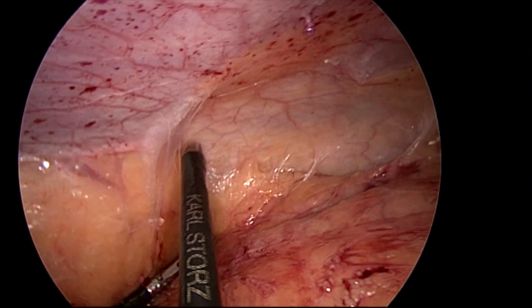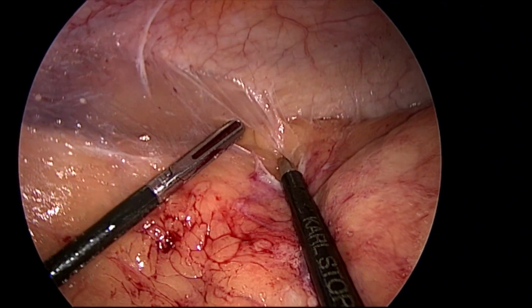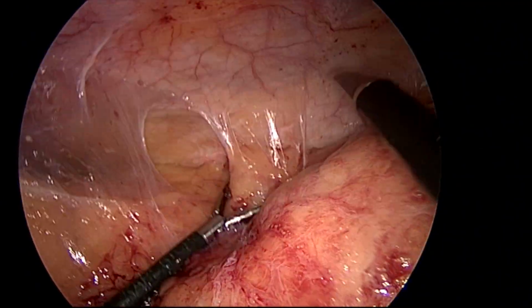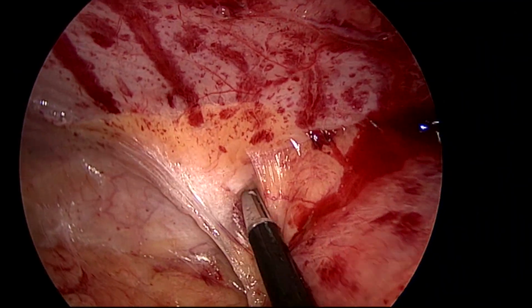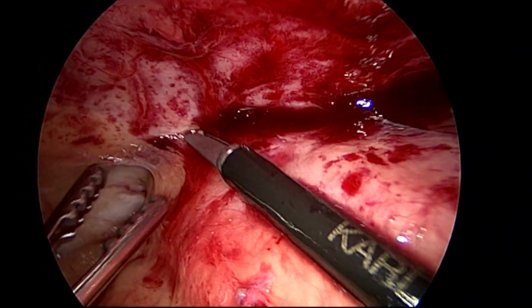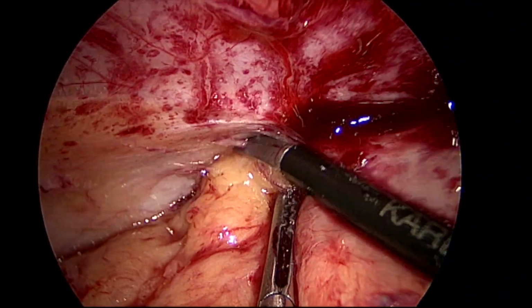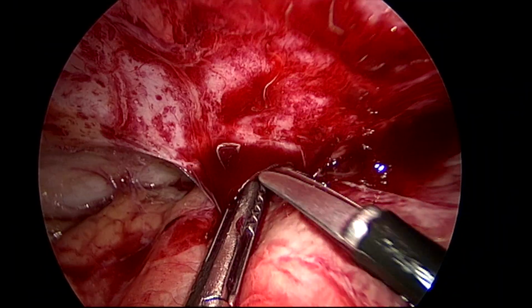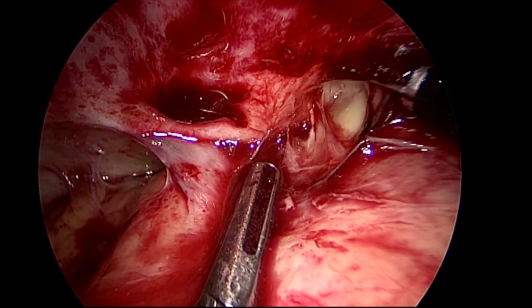In difficult cholecystectomy, one of the conditions is exposure difficulty. The gallbladder may sometimes be easier, but because of previous surgery in the abdominal wall or upper abdomen, exposure difficulty will be there. In this case there is no previous surgery, but because of the extensive inflammation, and this patient had an empyema gallbladder because of the acute infection and grade 3 acute cholecystitis.